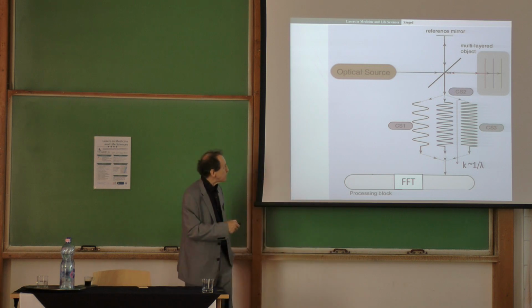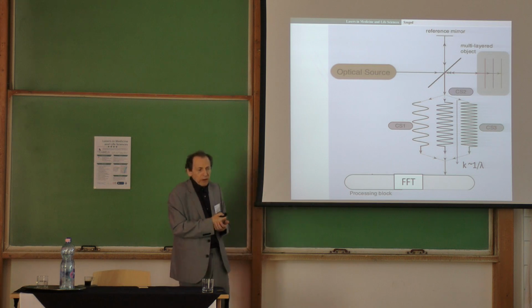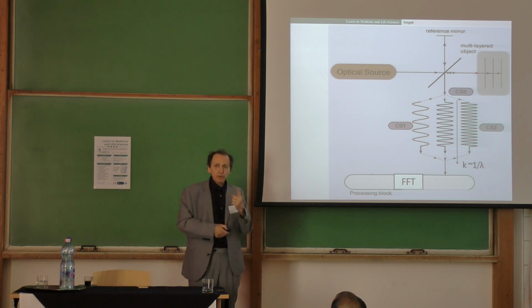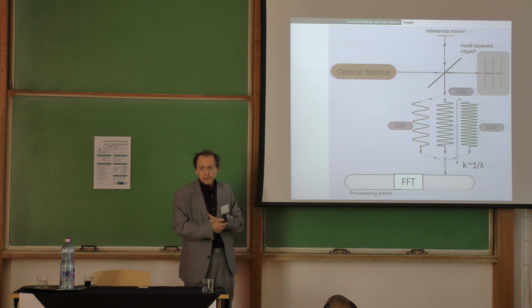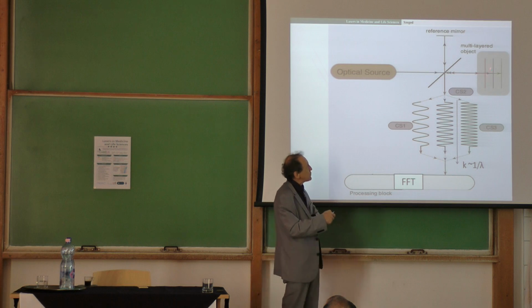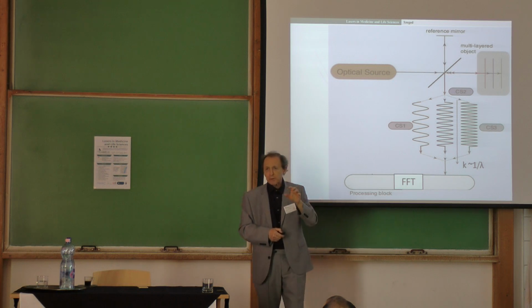So all these three signals are practically superposed in the spectrum, because the light coming from here comes at the same time. So you have this spectrum superposed. So practically what the camera will see, what the photodetector will give you when I shift that delta wavelength, will be a superposition of these three. So that's how the spectrum will look. For a sample made from three scattering centers, from three layers, you will have three modulations all superposed.